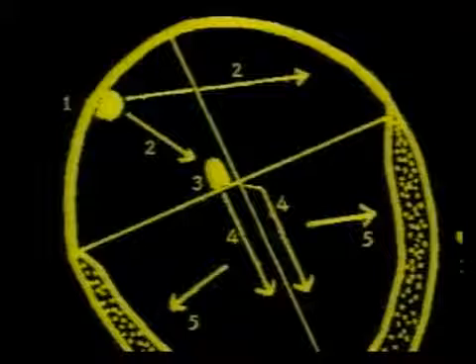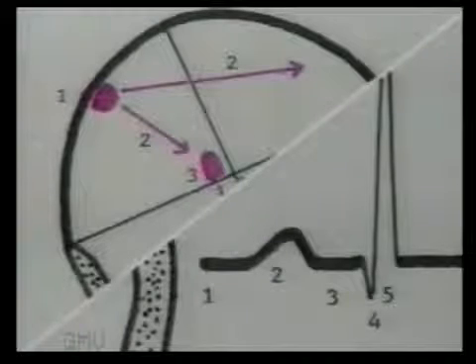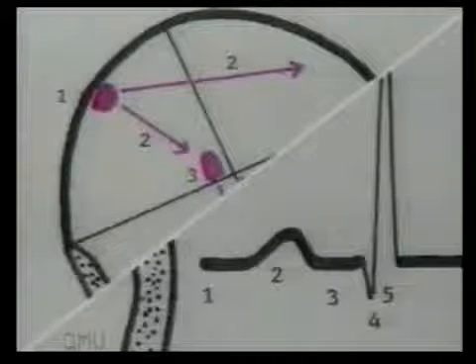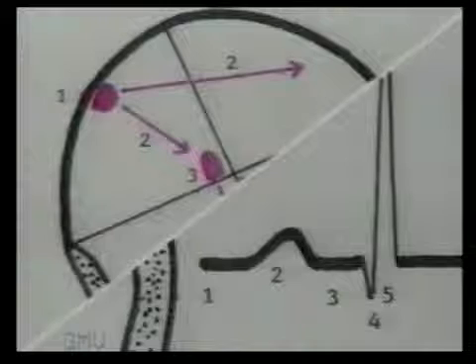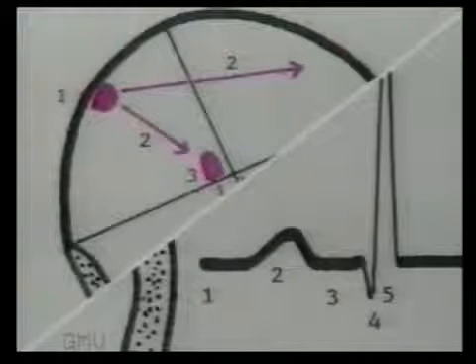to the ventricles. Now correlating the events to the ECG recording, the process of activation, that is depolarization, begins at the sinoatrial node or the SA node situated in the right atrium. Within 0.06 to 0.08 seconds, the atria get depolarized, which is recorded on the ECG as the P wave.